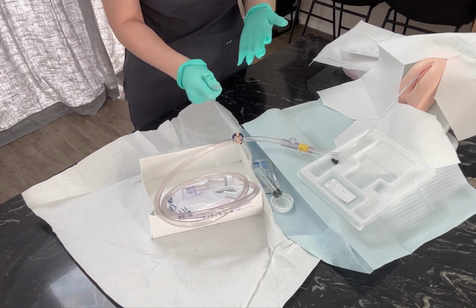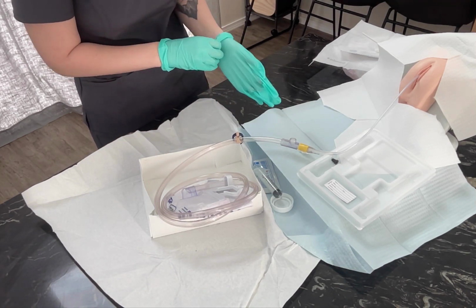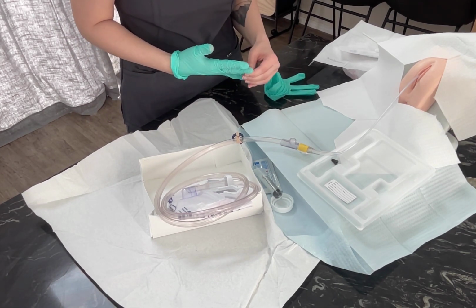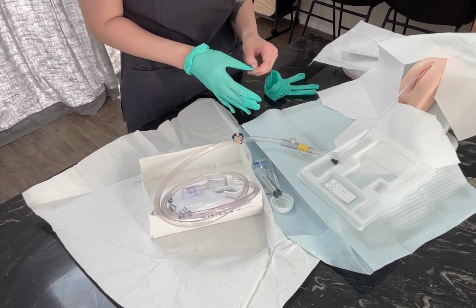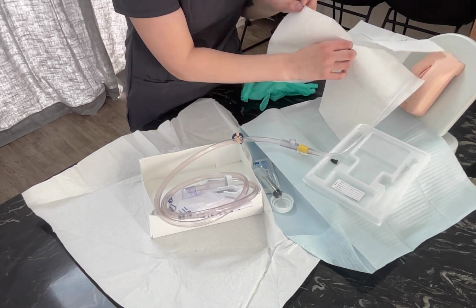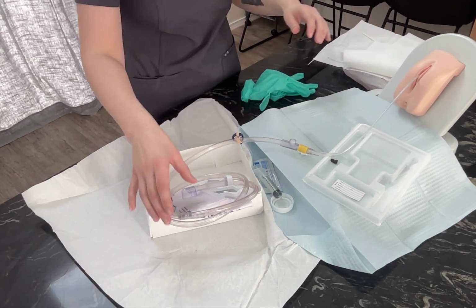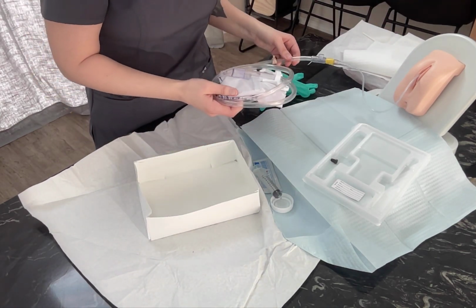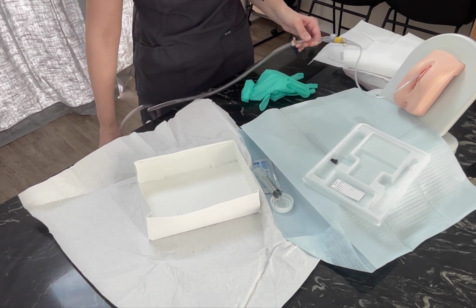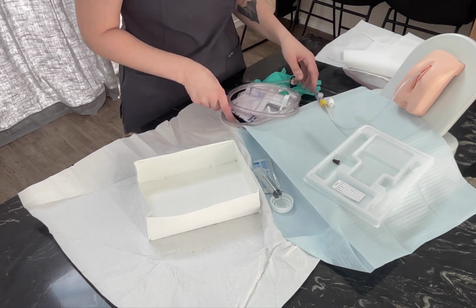All right, for the purpose of the fact that I might need to do more remediation, I'm just gonna take these off carefully. I would take all of my supplies and carefully dispose of them into the appropriate receptacle. I would attach this to Mrs. Smith's inner thigh, and I would hang this on the bed, not the rail, but on the bed itself, directly below the patient's hips. All right.